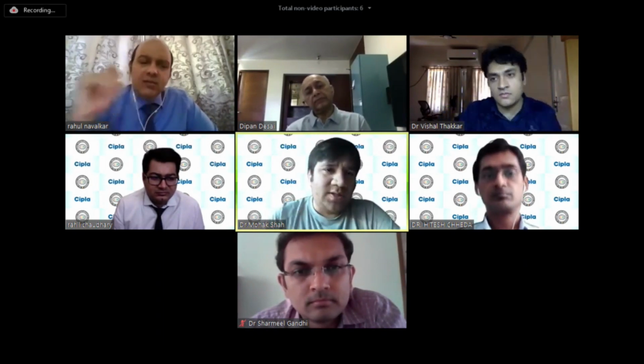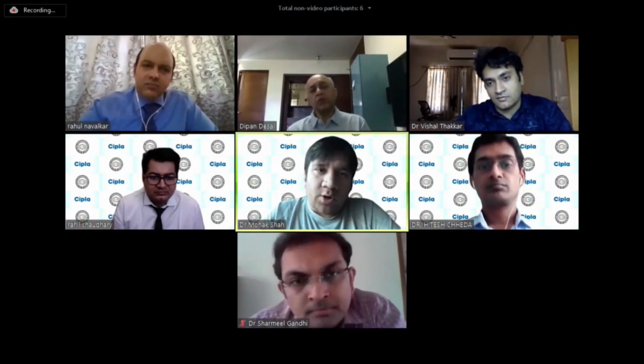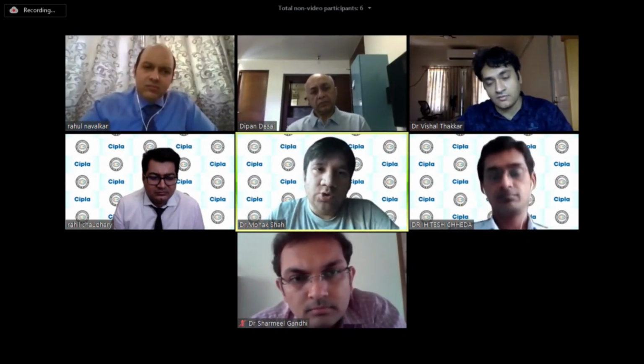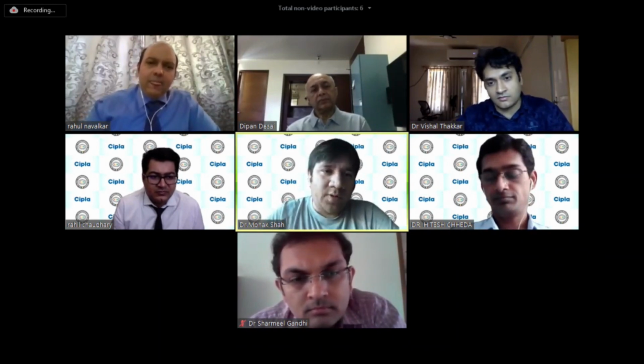And there is always some residual amount of auto-refractometer error. And of course, just like Dr. Deepan said, we do dilate all our patients compulsorily, those who have undergone this toric procedure, and we see the markings. Any other input from other panelists can help?